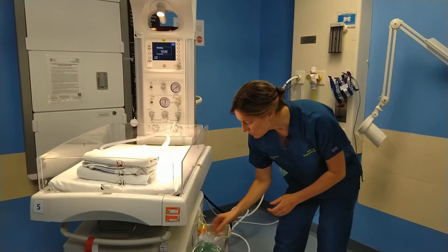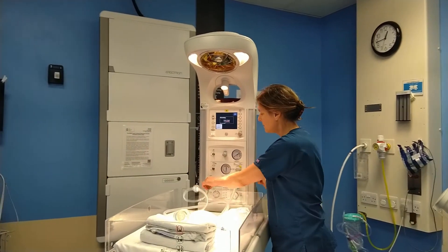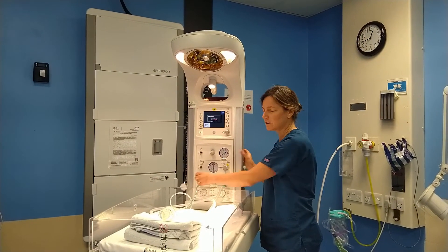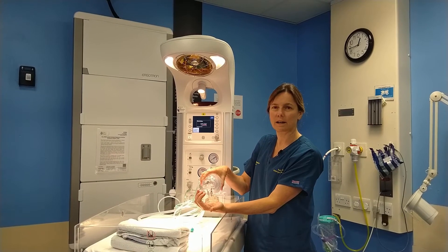Alternatively, in the drawer we've got a simple bag valve mask that can be plugged in to the port on this side, and you can use this dial to deliver oxygen using the bag valve mask and ventilate that way.